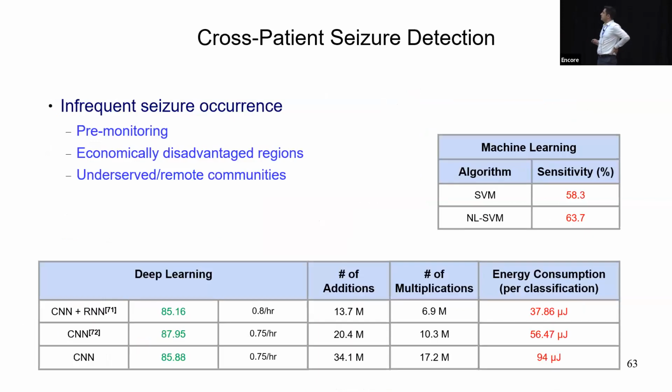The other challenge that is being investigated these years is cross-patient detection.